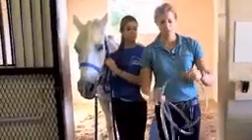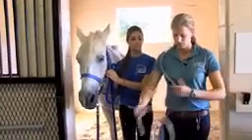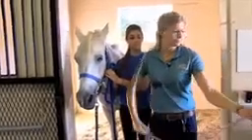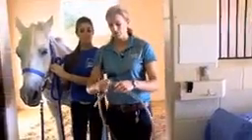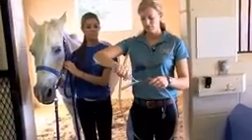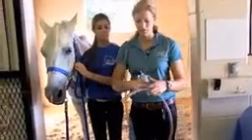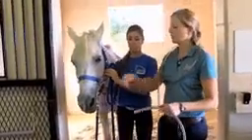So I get the tube here, and what I like to do is just put the tube around my neck like that. Just get the kinks out of it a little bit. And then I'm just going to grab some lube here just to make it pass easier through her nose. Just apply it to the end there. Okay, and then we're ready to go.